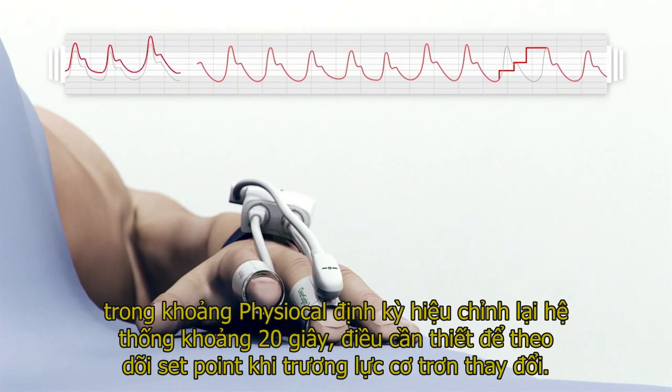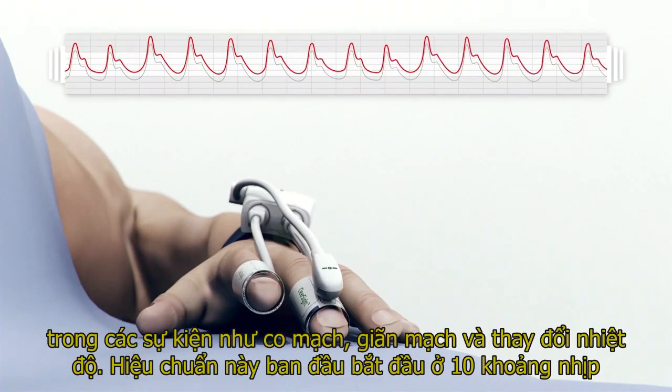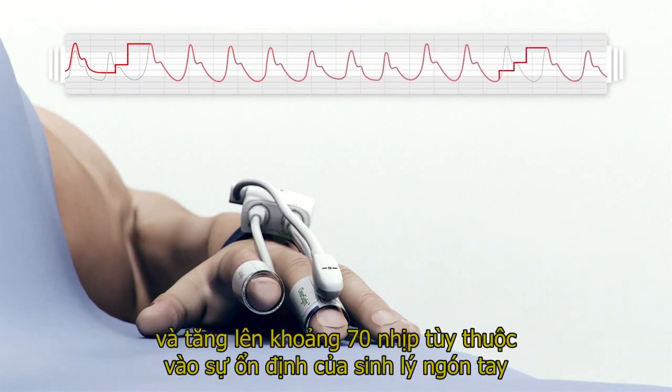PhysioCal periodically recalibrates the system, which is essential for tracking the set point when smooth muscle tone changes during events such as vasoconstriction, vasodilation, and temperature change. This calibration initially begins at 10-beat intervals and increases to 70-beat intervals depending on the stability of the finger physiology.